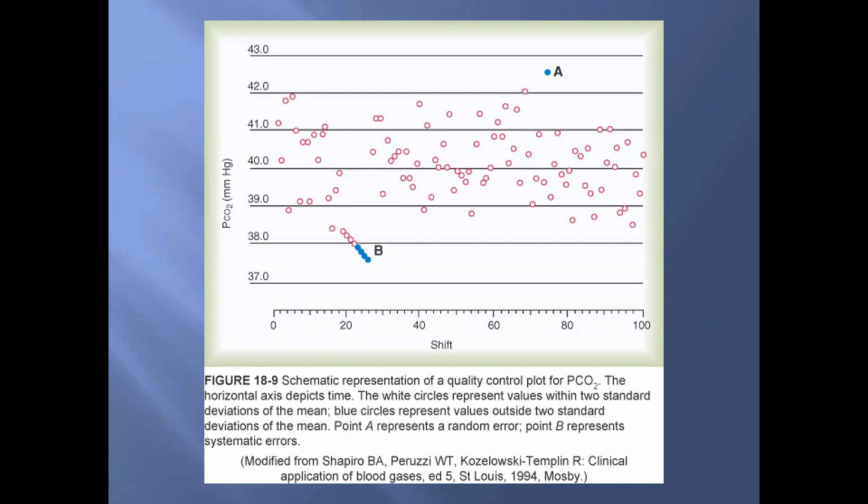So the typical problems could be that the electrode gets old, solutions dry out, maybe the little membrane needs to be changed. So those are examples of things that can go wrong with a blood gas machine. And now it's so automated, there's not a whole lot that you guys have to do. So other than somehow digging this information out of your brain to take your national exam, these blood gas machines are so automated. Like you don't have to get a vial. You don't have to warm it up in your hands. You don't have to make sure that you do the horizontal or the vertical. So it's all automated.